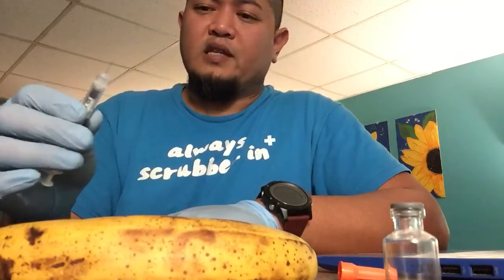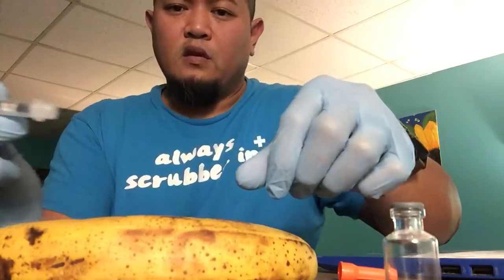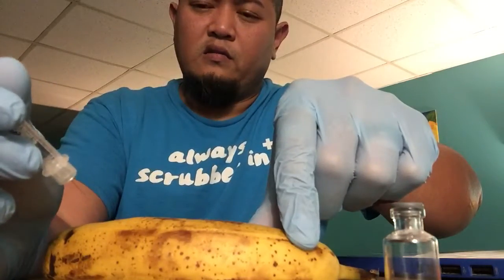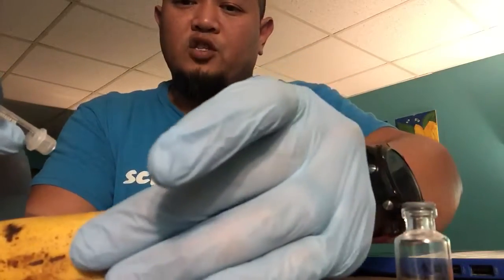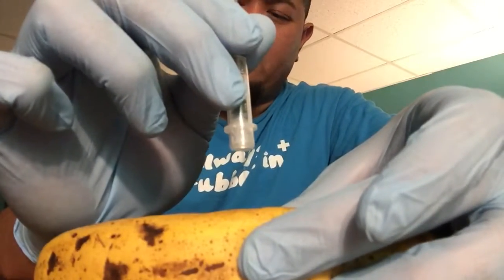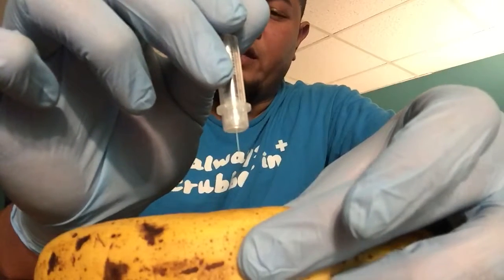Open up, take out the cap, make sure the needle is out of your way. Pinch it up. You can either give it at a 45-degree or a 90-degree angle. So you pinch the skin. I don't know if you can see it. Pinch the skin, either 90 or a 45-degree angle. So we're gonna give it at 90 degrees.